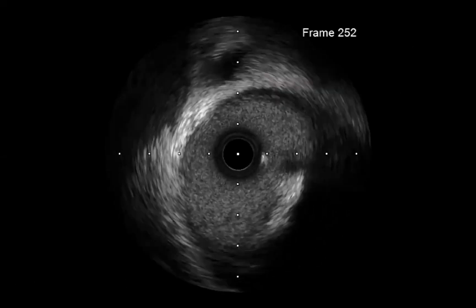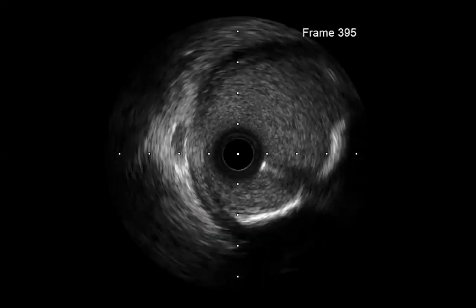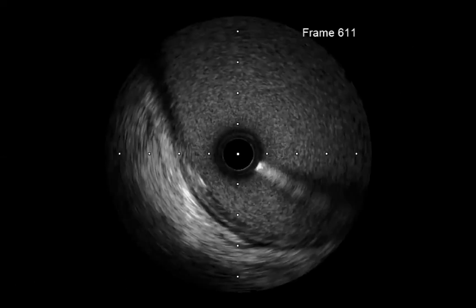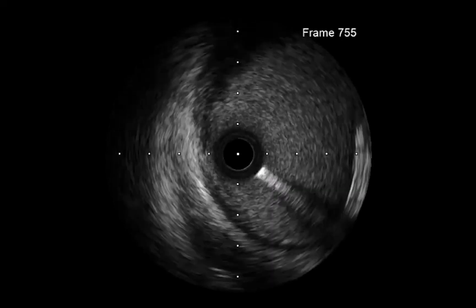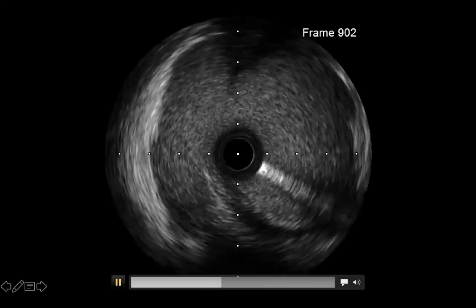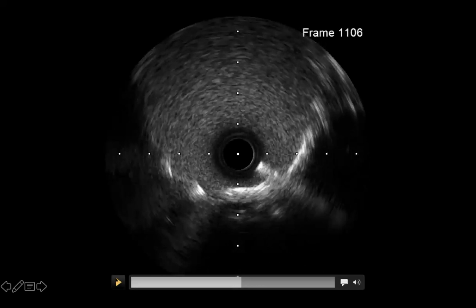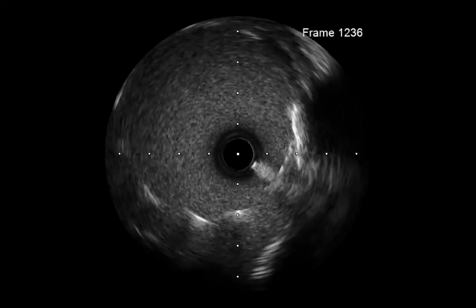So coming back to your point about the size of the left main, you're absolutely right. There's post-stenotic dilatation here. One of the accurate ways to assess the size of the left main is to look at the native circumflex and LAD, and work back using Murray's law to work out what the size of the left main should be. As you mentioned, there's no stent that is going to be able to expand much more than 6 millimeters, certainly no coronary stent. Biliary stents are a different matter.